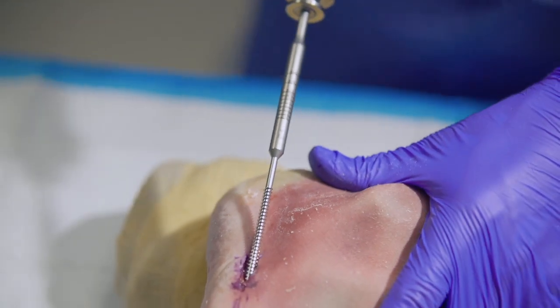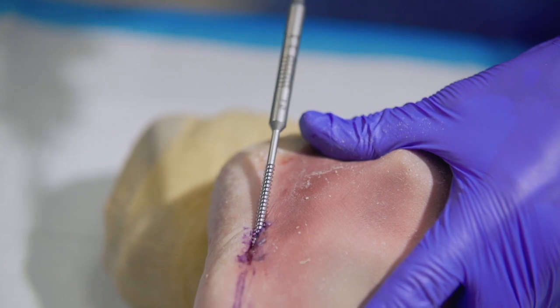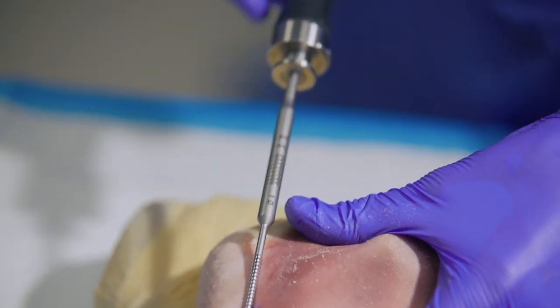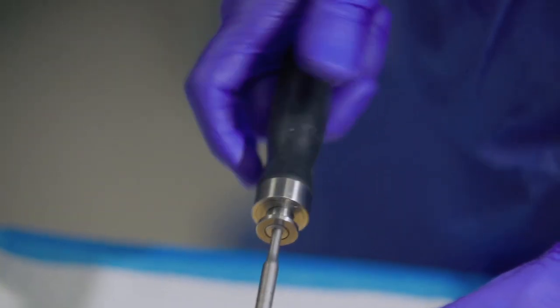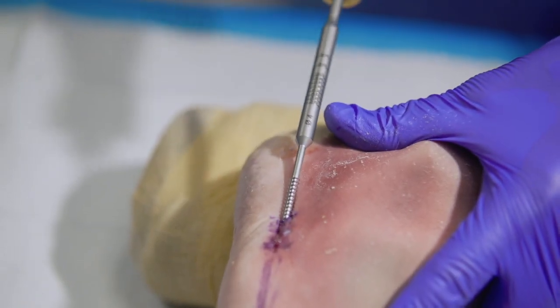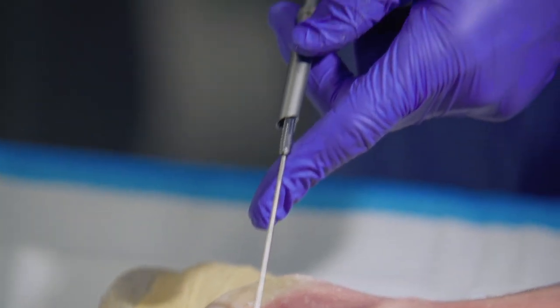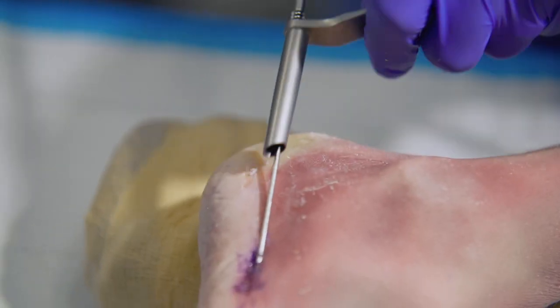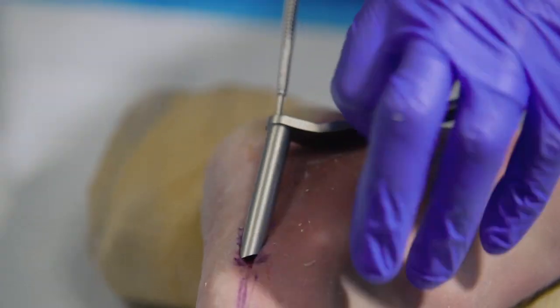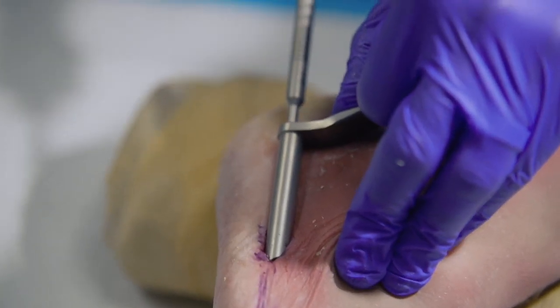So now we'll use the cannulated tap. We're beginning with a 4.0 tap and then we'll progress to a 5.0. Here we're utilizing the 5.0 tap with drill sleeve. The tap is also calibrated.